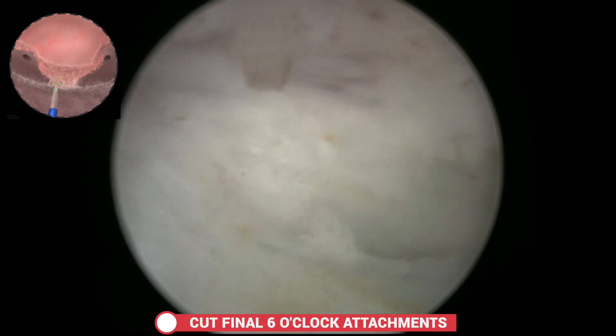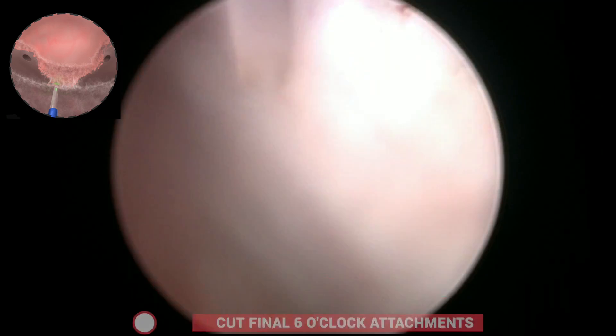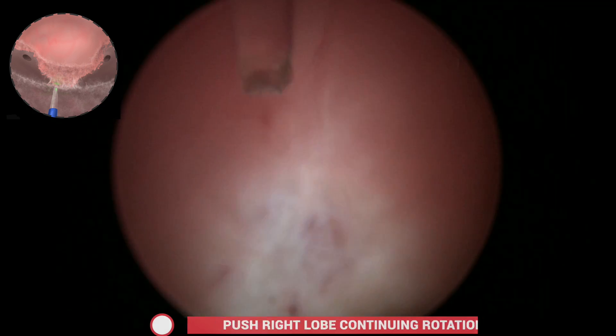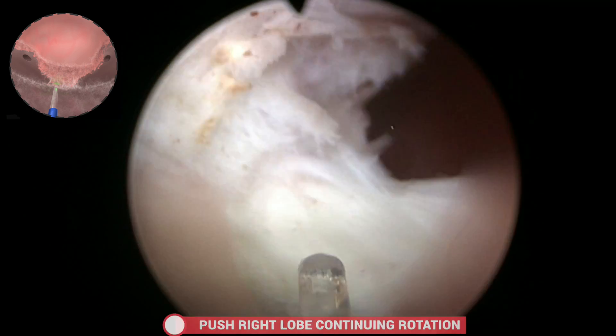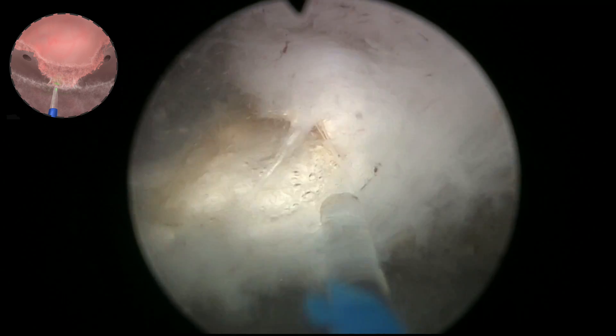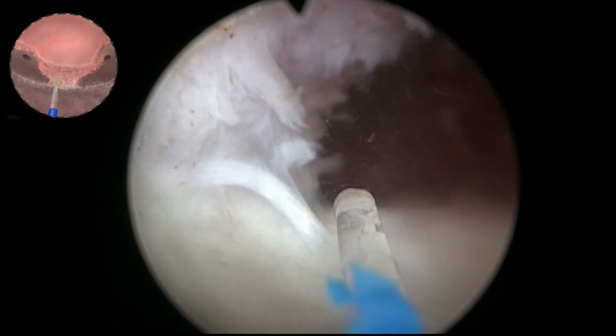Then the adenoma is lifted on the left side and pushed into the bladder, giving better access towards the 6 o'clock region. The pushing continues following the same rotational movement, so the adenoma goes into the bladder rotated rather than front-wise.